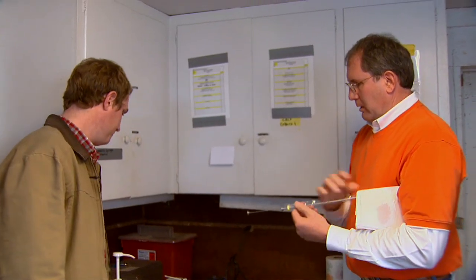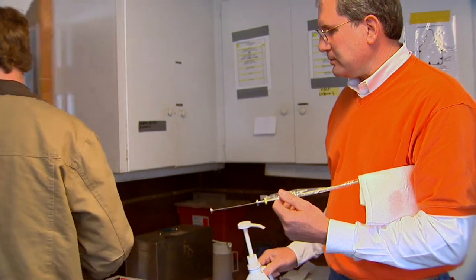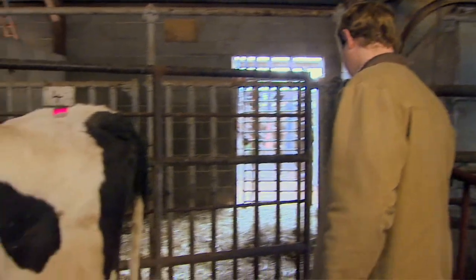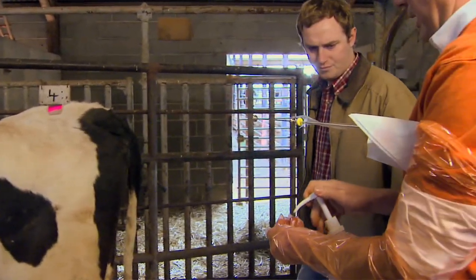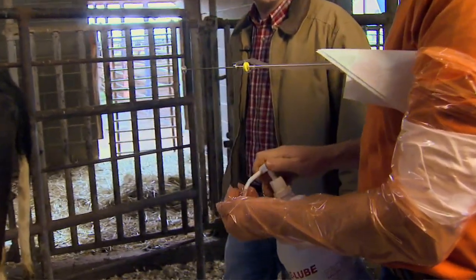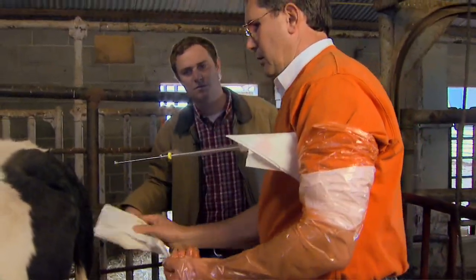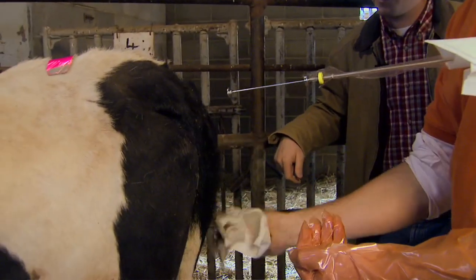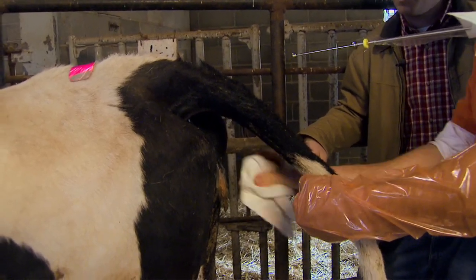Well, I guess we're ready to go breed a cow. Let's grab a glove and the lube and head that direction. It's very important that you use some type of lubrication. One of the main things we need to make sure of is that the cow is cleaned off behind, so I like to take a clean paper towel.